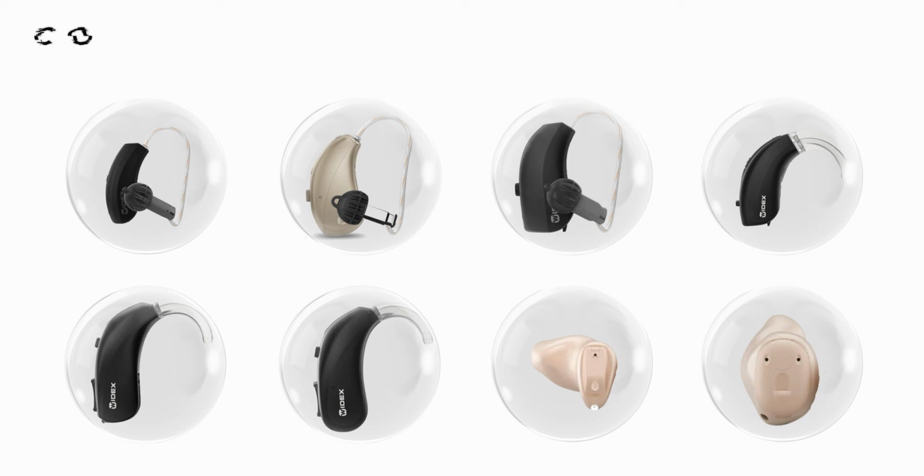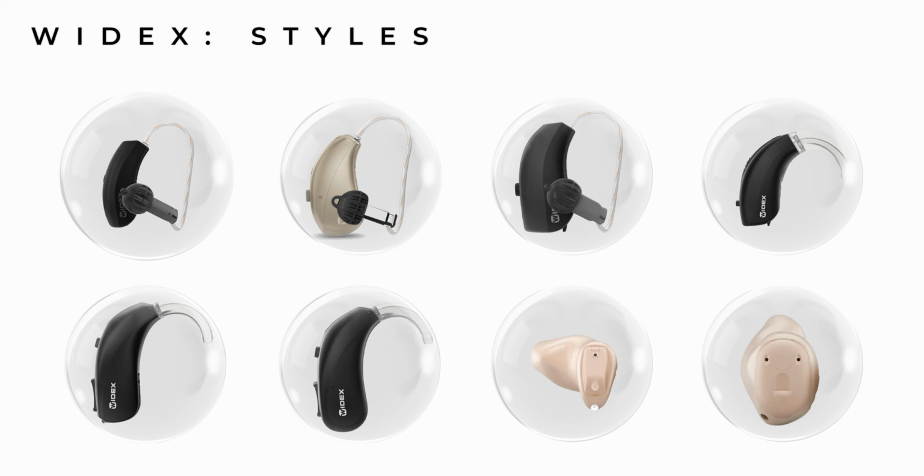At the time of making this video, the Widex Moment is Widex's latest hearing aid. And it's available in a range of different styles, which includes their RIC 10, SRIC RD, and their RIC 312D. Then going for their behind-the-ear models, it includes the BT312, BT13D, and their BTRD. We then finally come to their custom models, such as their CIC and ITE hearing aids.